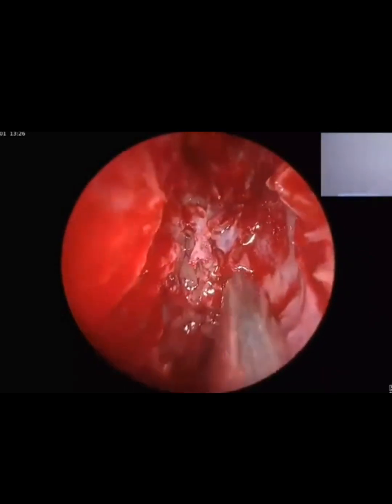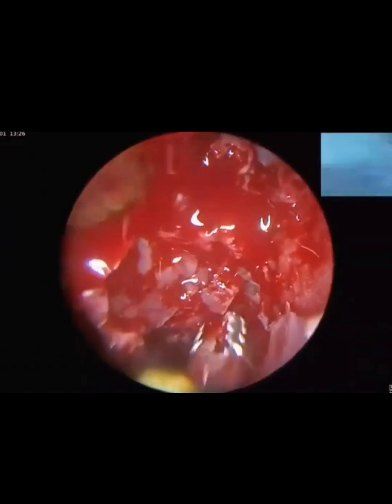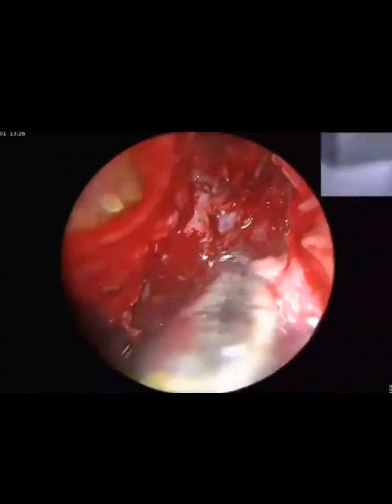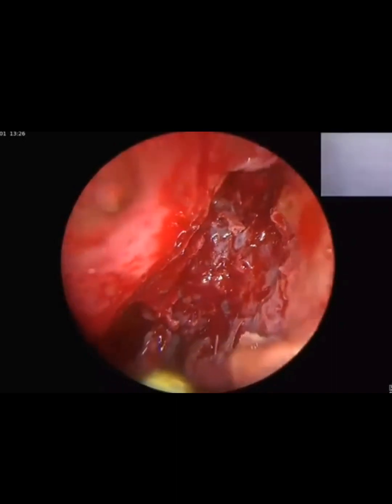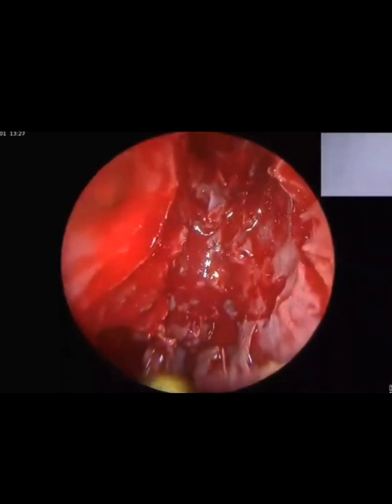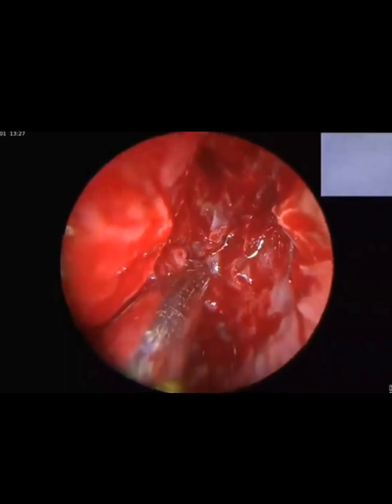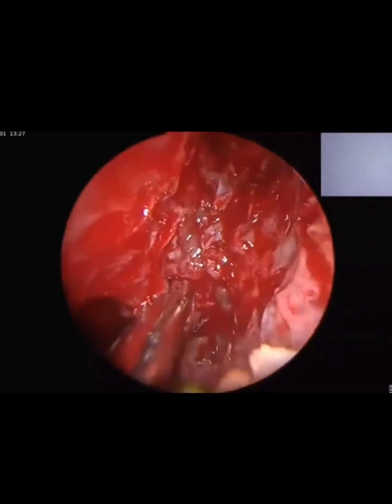First I clear the anterior ethmoid, okay, then I pierce the ground lamella, okay. Don't jump directly onto the ground lamella. So first I clear the disease in the anterior ethmoid area. Forceps. Thank you. Then clear the lamina area.